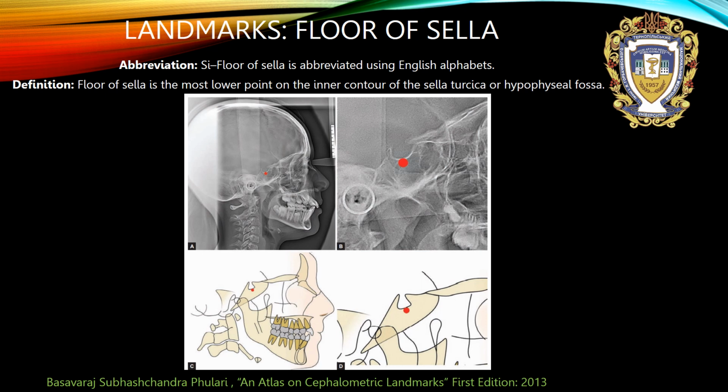Floor of sella or sella inferior is the lowest point of the inner contour of the sella turcica or hypophyseal fossa.